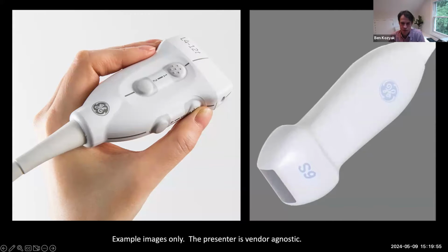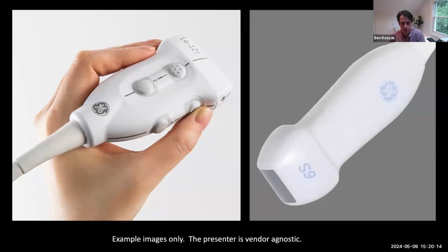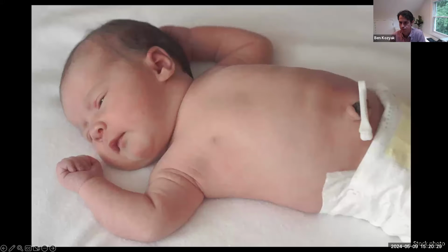The cardiac probes, the phased array probes, do a much better job at high frame rate imaging and color Doppler imaging. And so I often use this to confirm color flow within the vessel of interest before we start, just to make sure that it's patent. Now, obviously, it depends on the size of your baby. I have colleagues who do this in super premature babies, and this probe will go stem to stern. So in those kids, they'll use a smaller format linear probe or a smaller format cardiac probe.